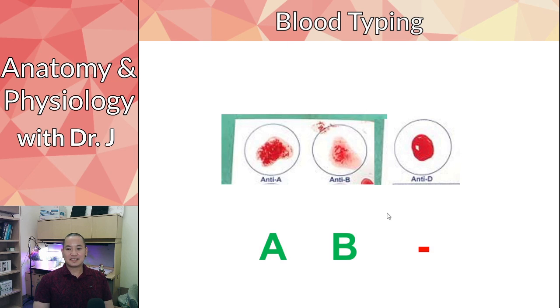So this is why, again, a lot of times people get confused with blood typing. They think, oh, this is detecting the patient's antibodies. The antibodies are actually on the card itself. You're actually detecting the antigens on the patient being tested. So again, this is how you use that. If you see agglutination, you put a check mark next to that antigen. And that's how you're able to use it.